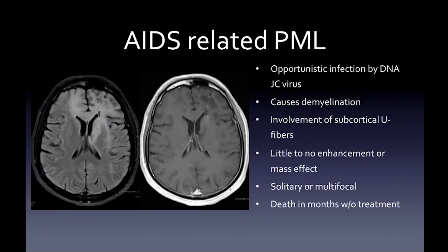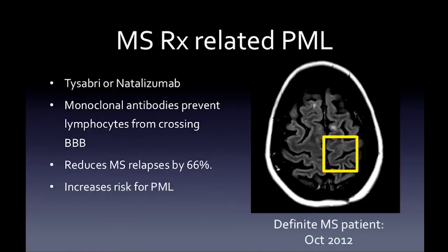PML — progressive multifocal leukoencephalopathy. The AIDS-related type is an opportunistic infection by the DNA JC virus causing demyelination, usually involving subcortical U-fibers with little to no enhancement or mass effect relative to lesion size. You can actually see volume loss, as in the left frontal lobe of this case. Lesions can be solitary or multifocal, and without treatment the patient will die within months.